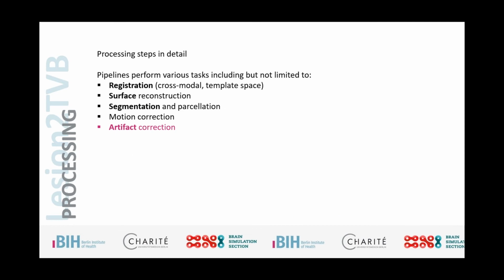So to take a closer look, what are the basic processing steps that we really want to perform and that are continuously performed throughout these large pipelines? We're talking about pipelines running for 20, 30 hours, but they continuously go back. If you look at the actual tasks that are performed, these are some of the main basic tasks that we want to look at.